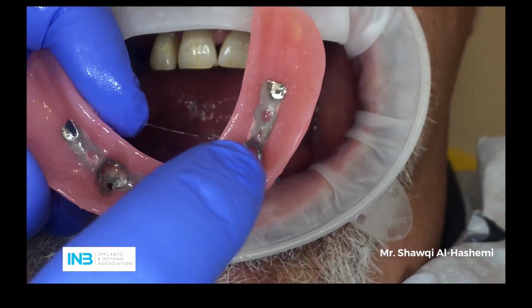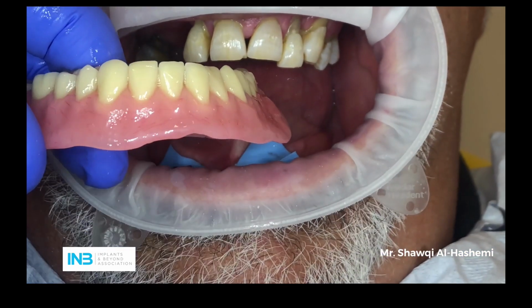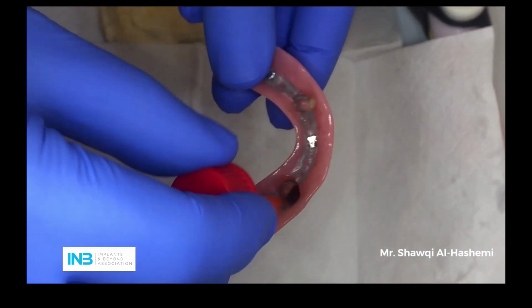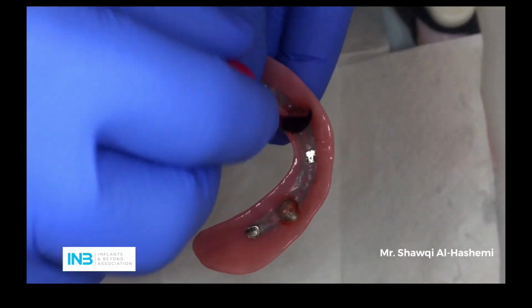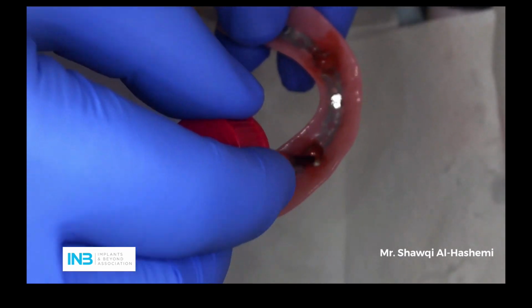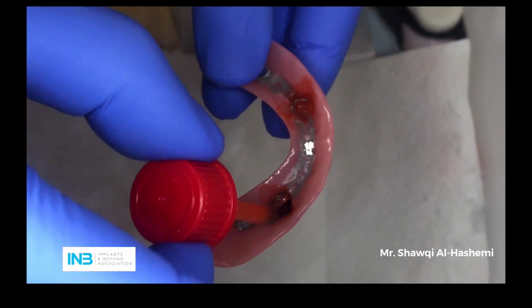If you open up for us now, what we need to do next is add the adhesive to these, and we use the acrylic, and then we'll engage it and leave it to set. So we're going to demonstrate that in a second. Okay, so this is the adhesive there. Just apply it here as well to make sure that your acrylic will take nicely. And just give it a couple of minutes to dry before you apply your resin.